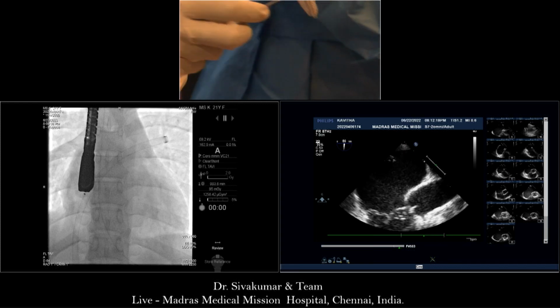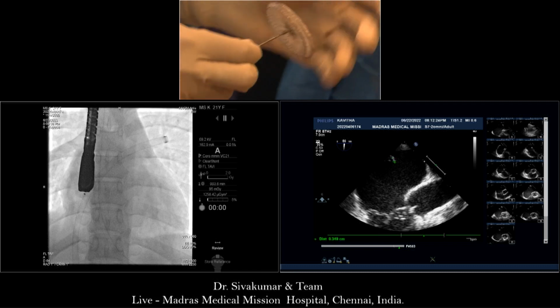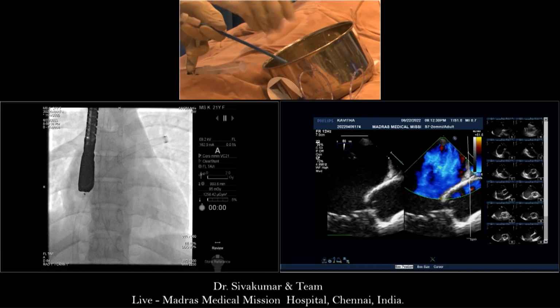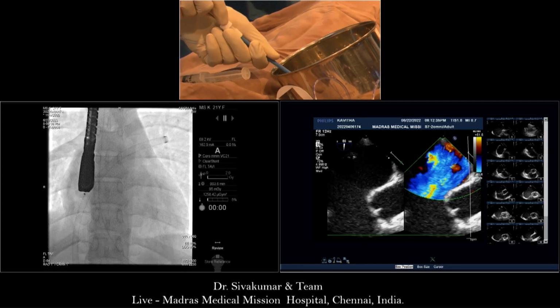On a bicaval view, after she rotates leftward, is there a bald aorta or not? It's around 29. Bald aorta carries a higher risk of erosion. 29. What did you say? On the bicaval, 29 is the measurement here.